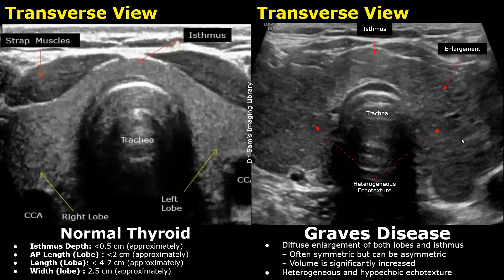There is diffuse enlargement of the thyroid, which means all three parts of the gland are enlarged — the right lobe, left lobe, and the isthmus are all enlarged. The echo texture is heterogeneous and also hypoechoic. You can see the difference in the echo texture by comparing it with a normal thyroid.